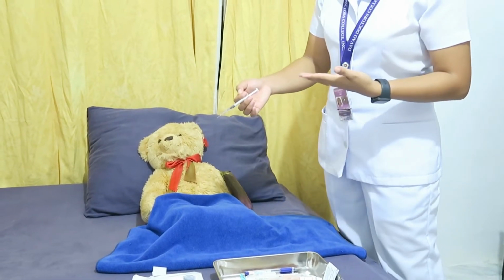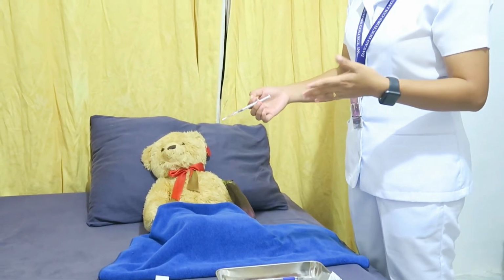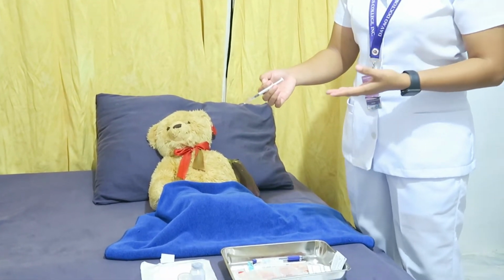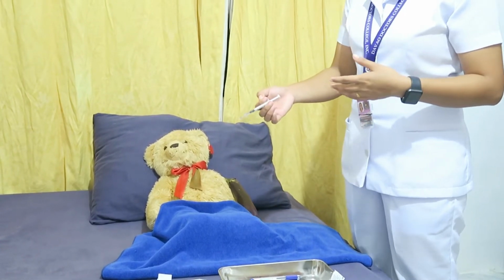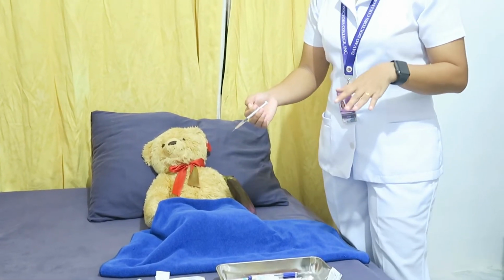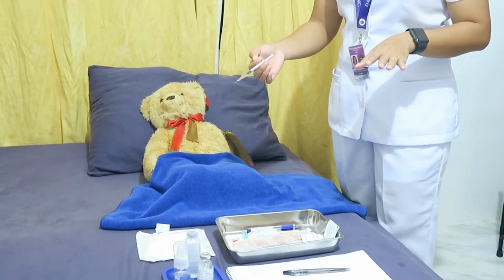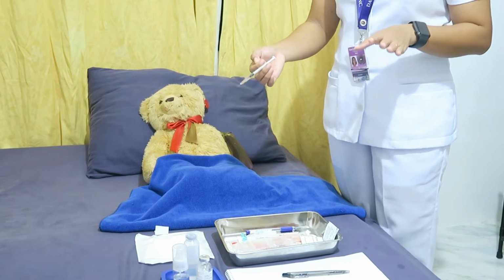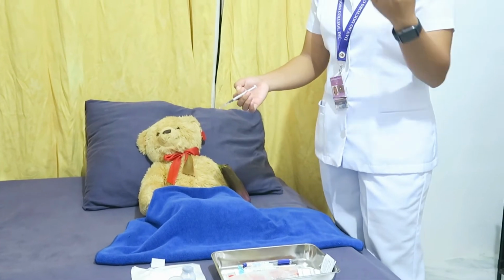So let's inject the fluid. With the non-dominant hand, pull the skin of the site just like that until it stops. For example, if you're using the ventral forearm, grasp the client's dorsal forearm and gently pull it and tighten the ventral skin. After that, insert the tip of the needle far enough to place the bevel through the epidermis into the dermis. The rationale for this is that taut skin allows for easier entry of the needle and less discomfort for the client.